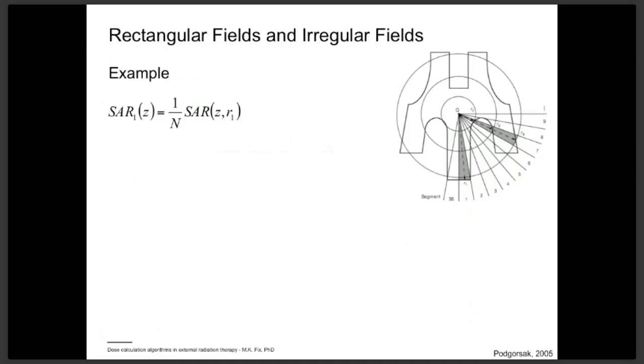This part is blocked and this is open again. So we need to have a scatter contribution, which is a superposition of the involved segments, going from the center to this border, to the second border, and the outermost border. And this is done as shown here.